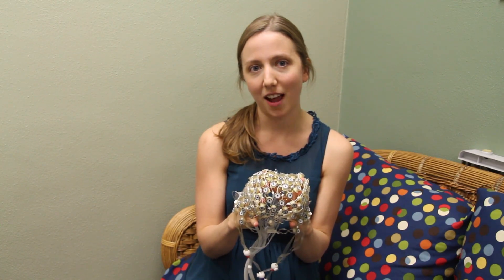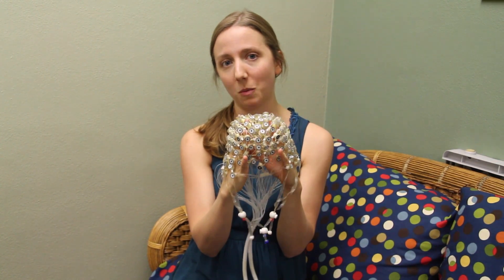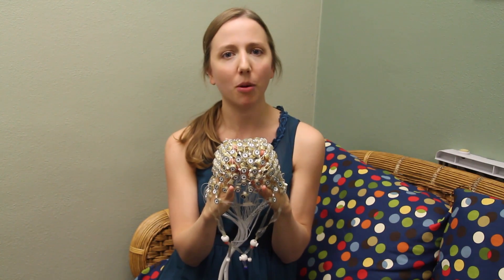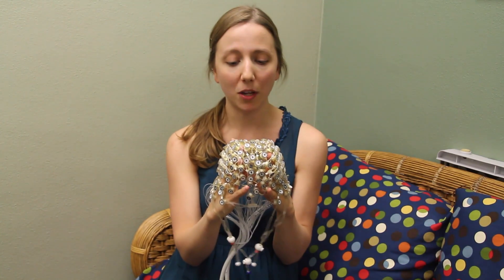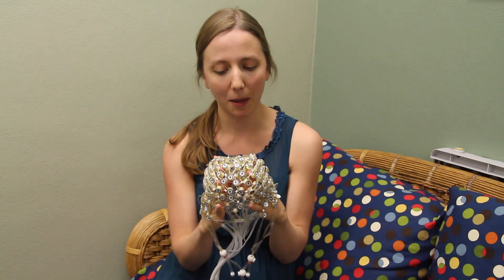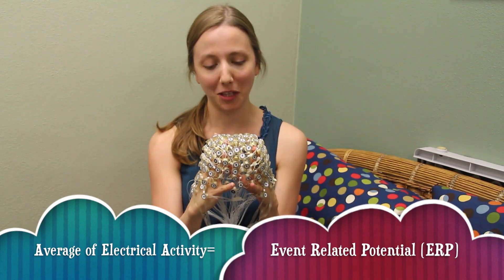What we have kids do while they're wearing the net is play special computer games that are designed to test different skills — for example, attention, learning, or memory. We record the electrical activity generated by the brain that we can measure from these sensors at the scalp. Then we can average together the electrical activity for certain parts of the computer game, and look at how the brain's electrical activity is different when you're remembering something versus when you've forgotten an item. That average of the electrical signal is called an ERP — an event related potential.